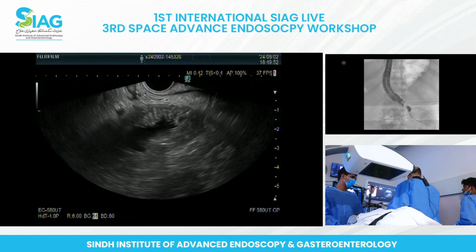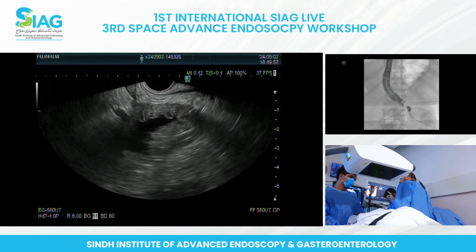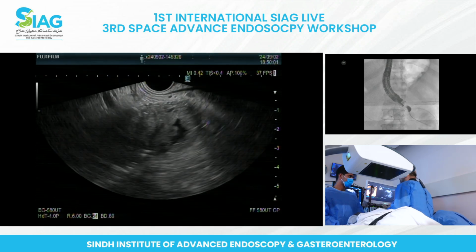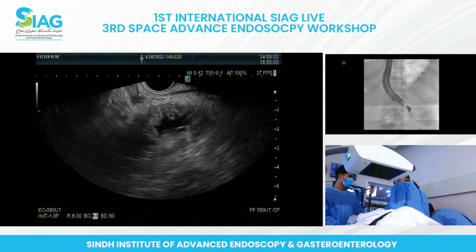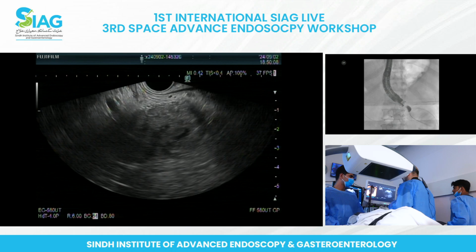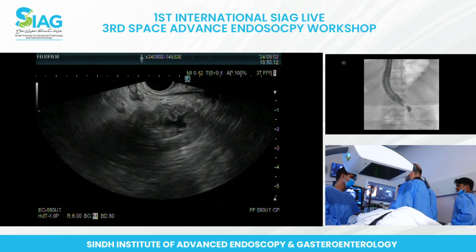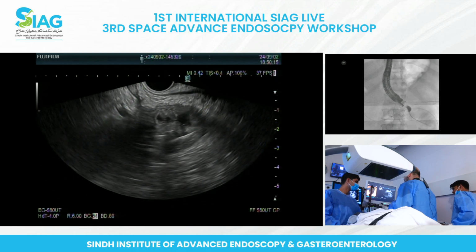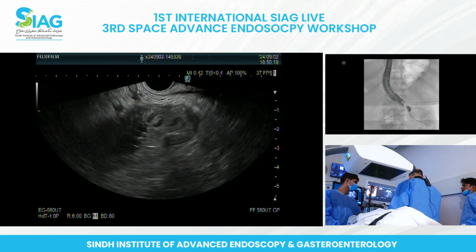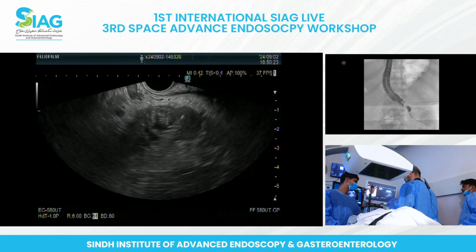So 15-10 Axios I need, and secondly over there we give glucagon, but whatever anti-motility agent. Okay. You know, we should have glucagon, but we don't use it because of the cost. What we use is we give atropine. Yeah, I think we just gave that. 1 cc diluted in 10 cc, 1 ampule, and then we just give 1 cc, and that works for us for most of the cases. We use that for ERCP.